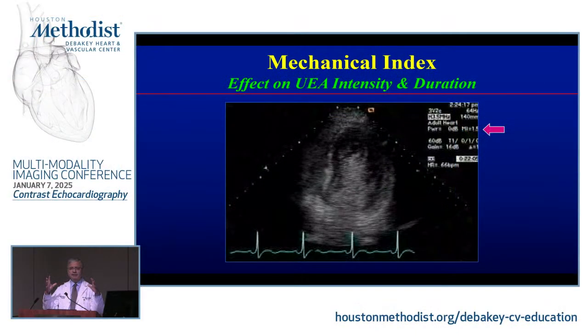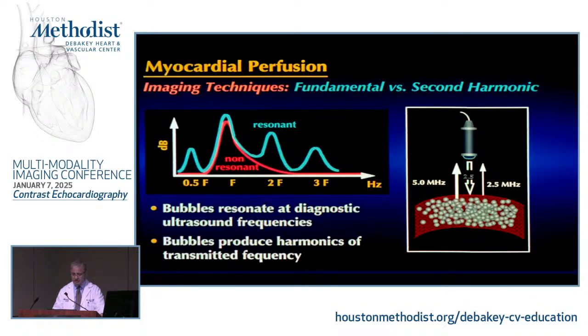There's another possibility for you to have that, I don't have a case for you, which is if you have a huge ventricle with a big apical aneurysm, where you have stagnation of contrast when it comes in. No matter what you do, this contrast that is in the apex that is not leaving the apex is bombarded. So the base will look good, but the apex doesn't look as good, right? So you try to decrease the index as much as you can, inject a little more contrast, particularly if you're looking for a thrombus in that apex and you want to visualize it as much as possible.